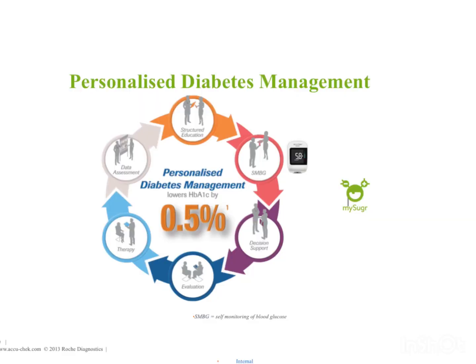Roche actually also produces the AccuCheck blood glucose monitoring system. So, do you think that they will compromise on accuracy? No, I guess not. So it is very important to always choose a blood glucose monitoring system that has the accuracy level or that sits on the ISO standard or ISO criteria.